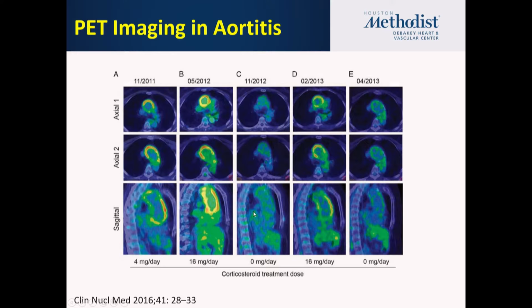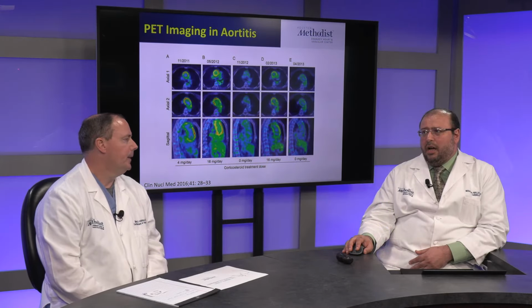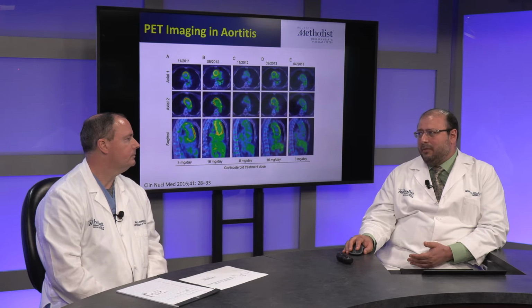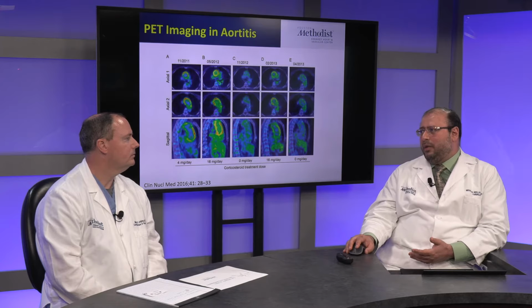In one of those patients, how often would you repeat their PET imaging to adjust therapy? I would say if there is worsening of clinical symptoms, obviously that would be one way to look at it. The other thing is, after major changes, once you have demonstrated that you have suppressed inflammation, with major changes in the dose, like stopping it, you want to confirm that it doesn't come back again. Gotcha.